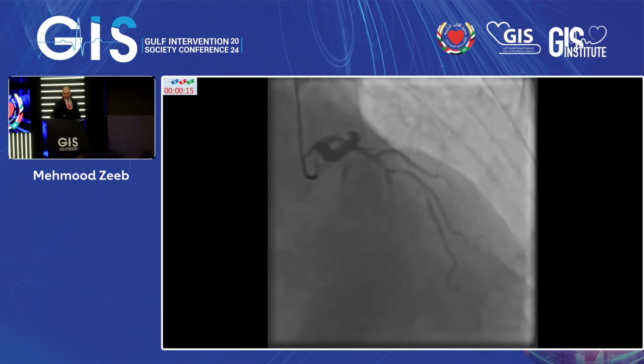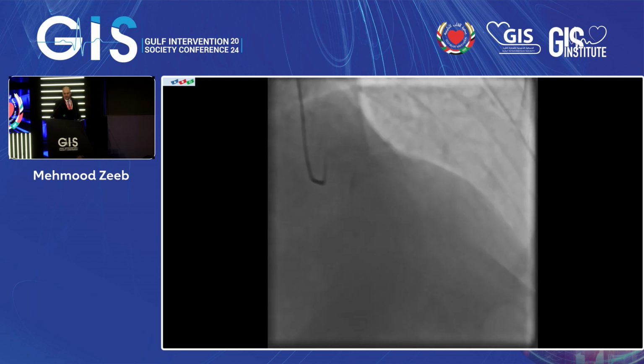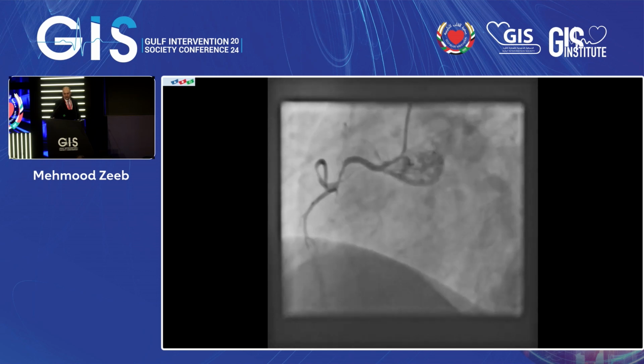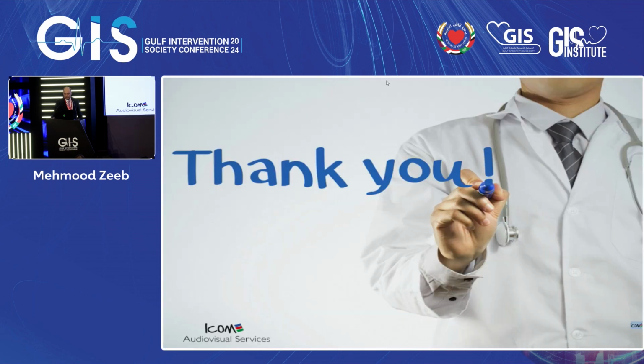I'll show you the LAD, so significant disease in the LAD. Multiple bifurcations, and the RCA was small. So, as I mentioned, I left the branch of OM alone without opening.